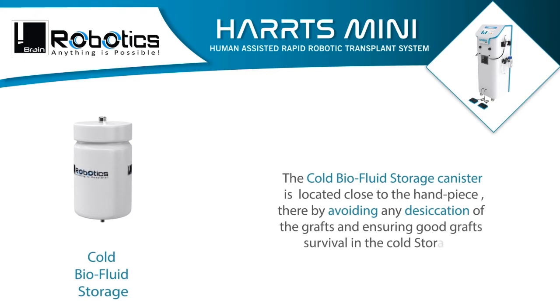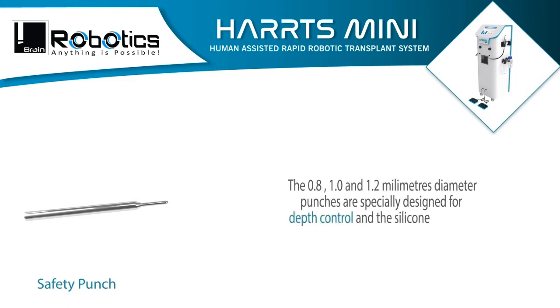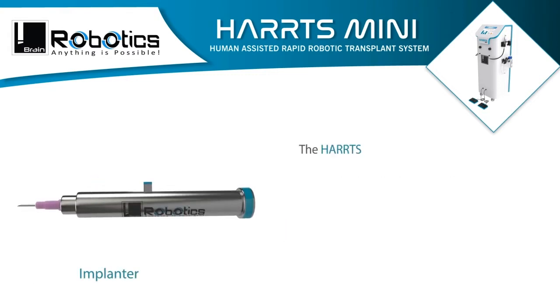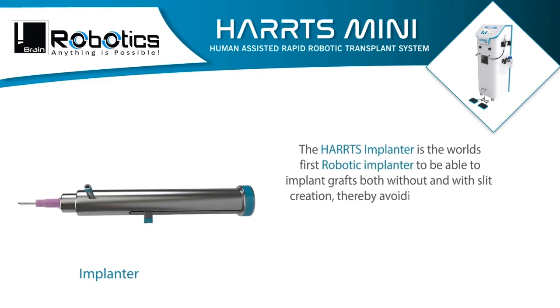The cold storage canister avoids any desiccation of the grafts, ensuring good graft survival. The 0.8, 1.0, and 1.2 millimeter diameter punches are especially designed for depth control, and the silicone covering over the step avoids rotational skin abrasion.